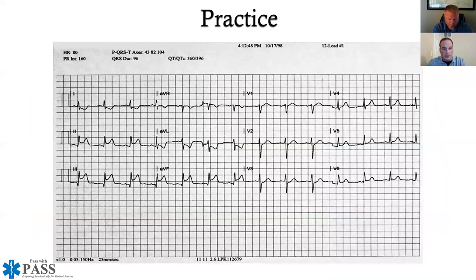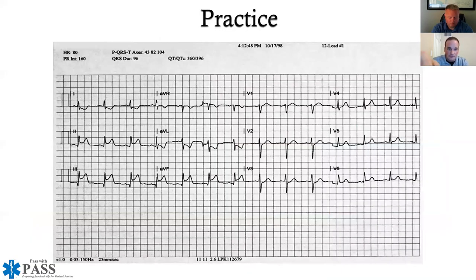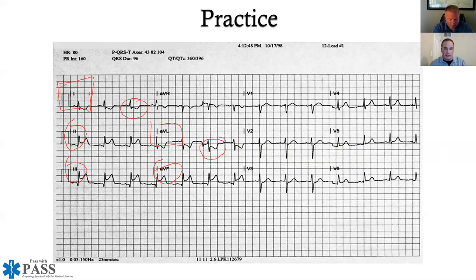Looking at the same strip again: ST elevation in leads II, III, and AVF confirms an inferior wall MI. Inversion in leads I and AVL represents the reciprocal changes in the lateral leads. Those reciprocal changes are not required to call the MI but serve as extra evidence — the inferior wall MI with reciprocal changes in leads I and AVL.